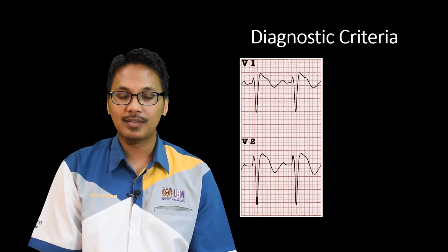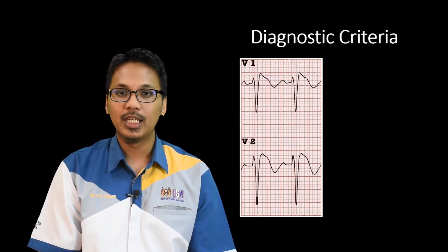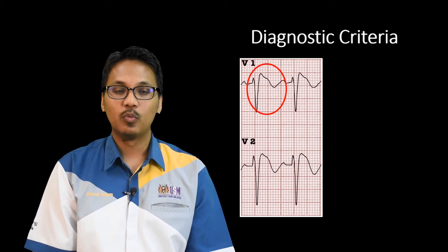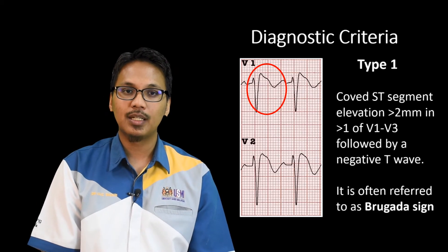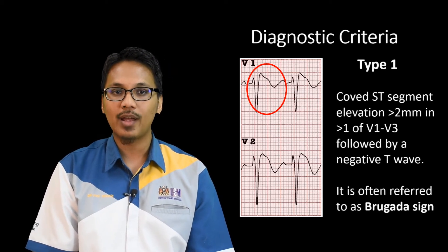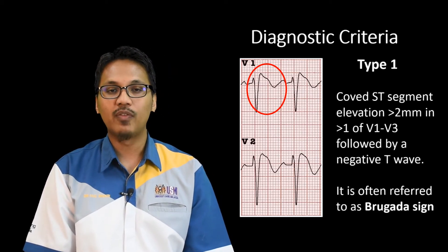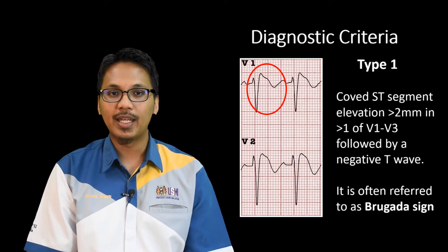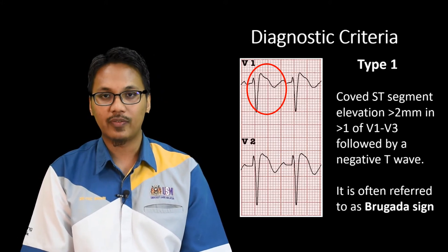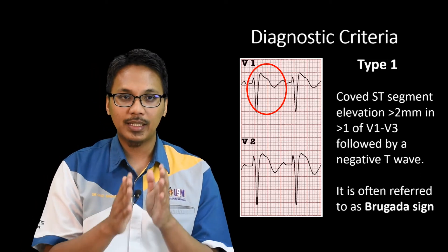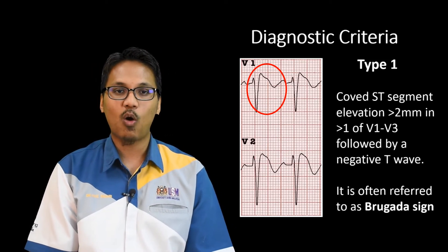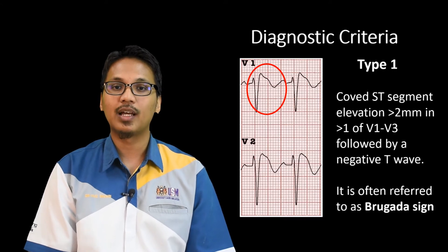As you can see from the example in the red circle, there is a coved ST segment elevation of more than 2 mm in more than one of V1 to V3 leads, followed by a negative T wave. This particular Type 1 ECG change is often referred to as the Brugada sign.